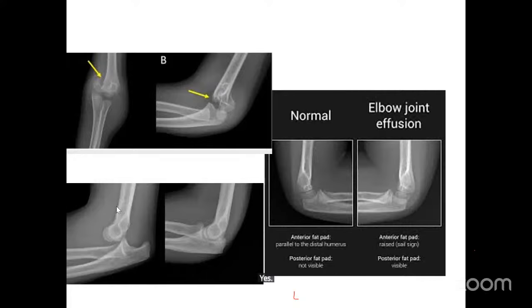Is that subluxation? No, there's no subluxation. It's intact. This is an epiphyseal end. That's the epiphysis. It's for a growing child. Okay, now look at it carefully. On a careful assessment, look at this image, where my cursor is, anterior to the, what's the name of this process?